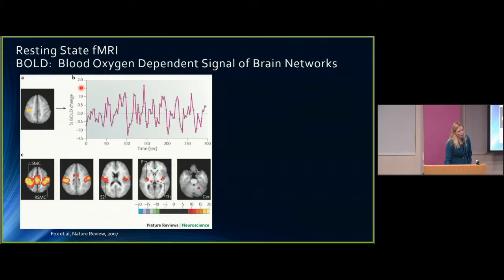So all we need to do to detect all of the major brain networks of any individual is to have them in a regular MRI machine. Typically we do this for about 20 minutes. And we can see the cognitive networks, the language networks, the vision networks, the deep gray networks. And this has been borne out in tens of thousands of individuals, including children and neonates. And at no point in time has it ever been detected that this wasn't true for a human being.